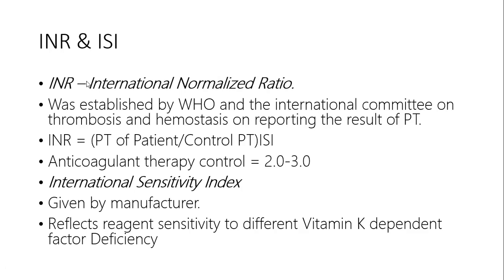Next, we have the INR and ISI. So INR stands for International Normalized Ratio. This was established by the World Health Organization and the International Committee on Thrombosis and Hemostasis on reporting the results of the prothrombin time.